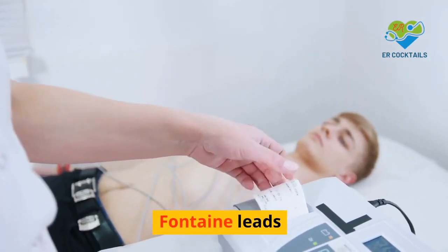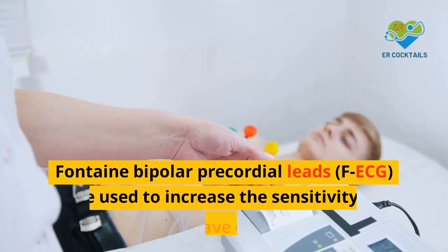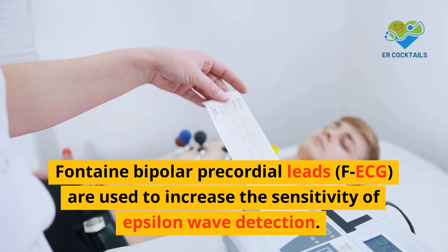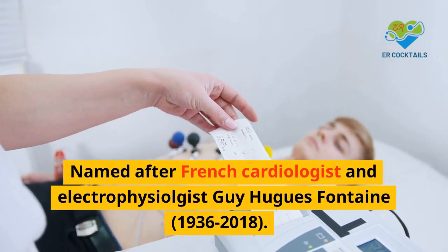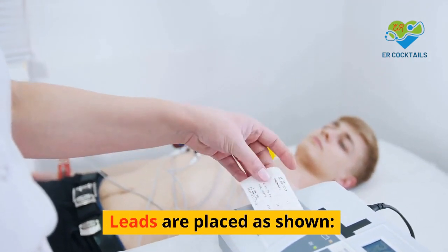Fontaine leads. Fontaine bipolar precordial leads, FECG, are used to increase the sensitivity of epsilon wave detection. Named after French cardiologist and electrophysiologist Guy-Hugues Fontaine, 1936 to 2018. Leads are placed as shown.